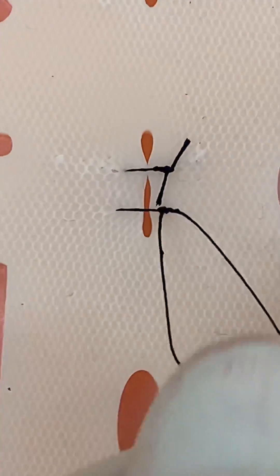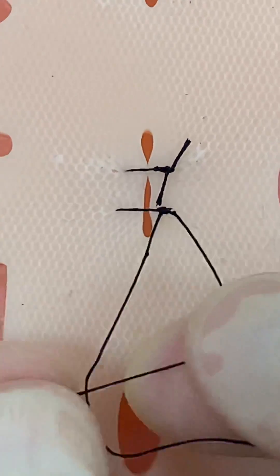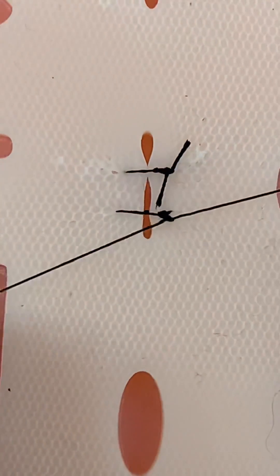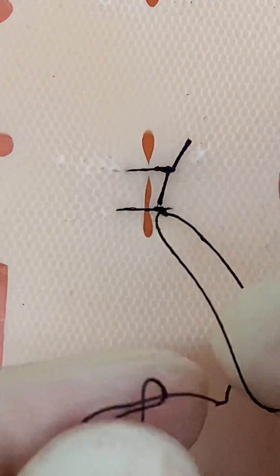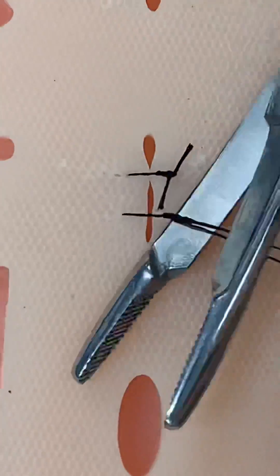It's also much slower tying knots without instruments, so the triple throw had time to loosen before I could secure it with the square knots. And the wound edges didn't come together as nicely. So instrument tying is definitely the way to go.